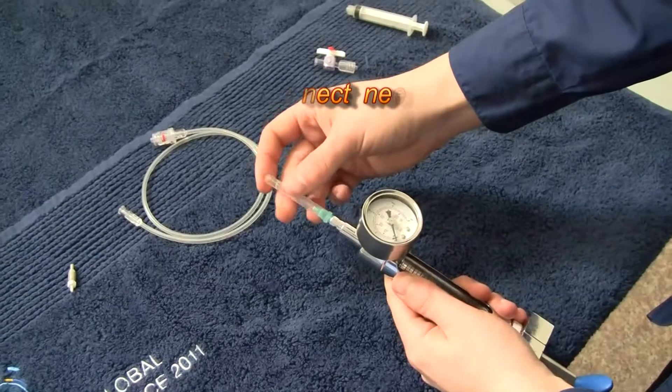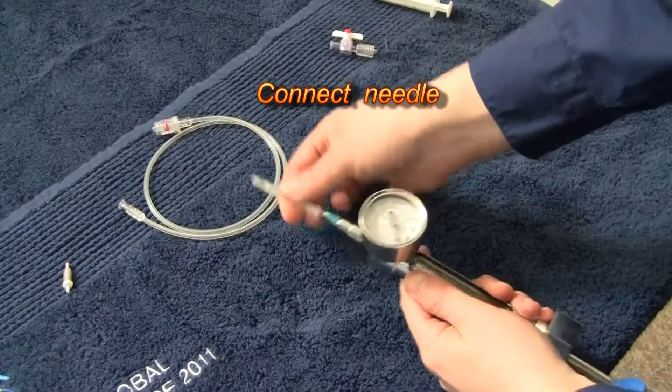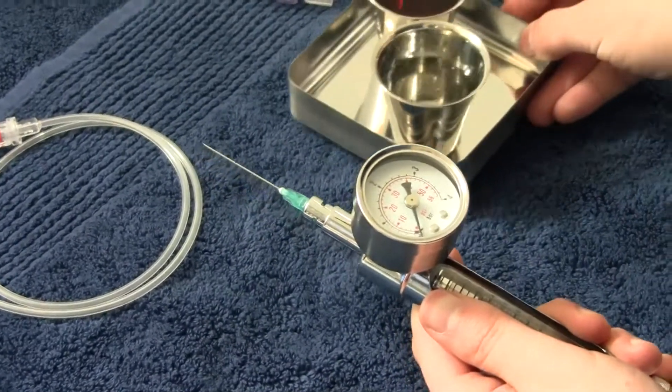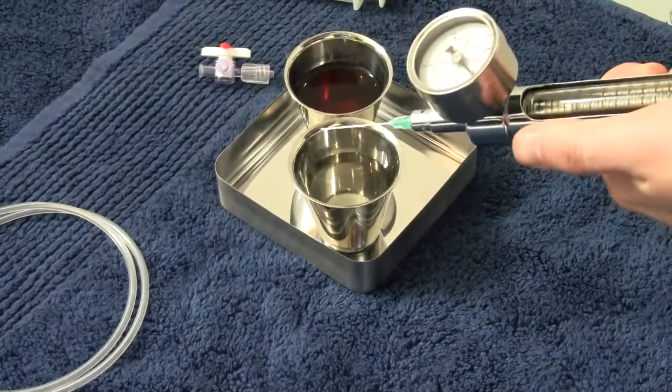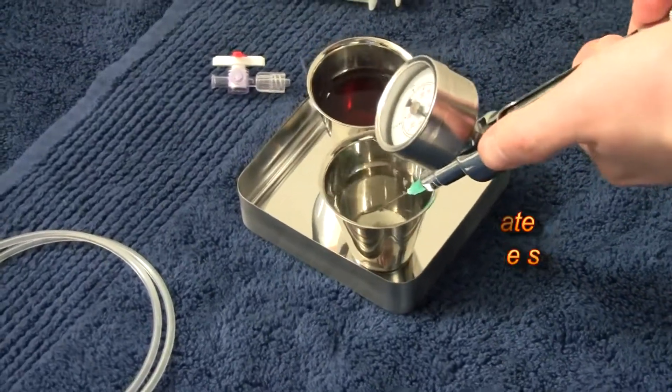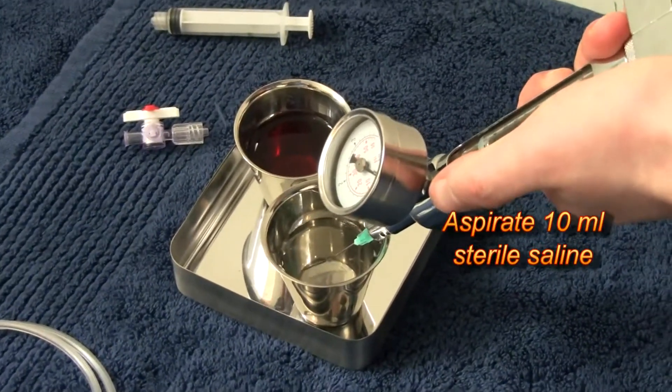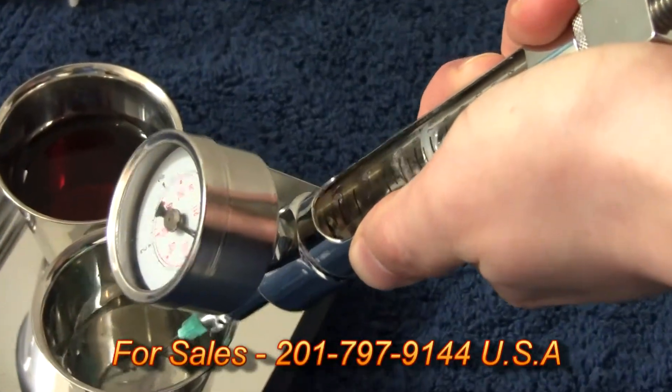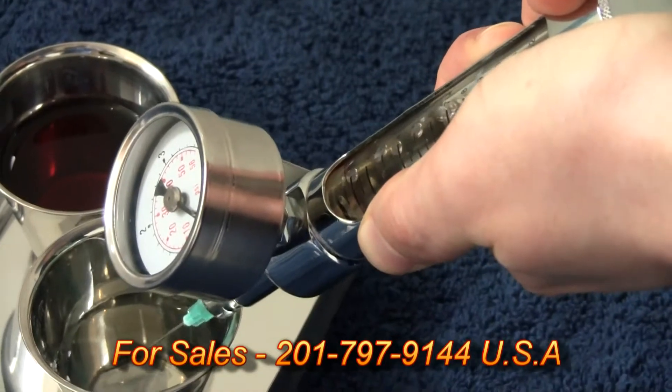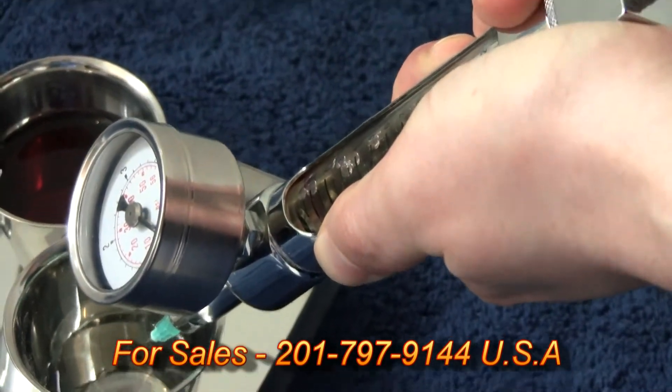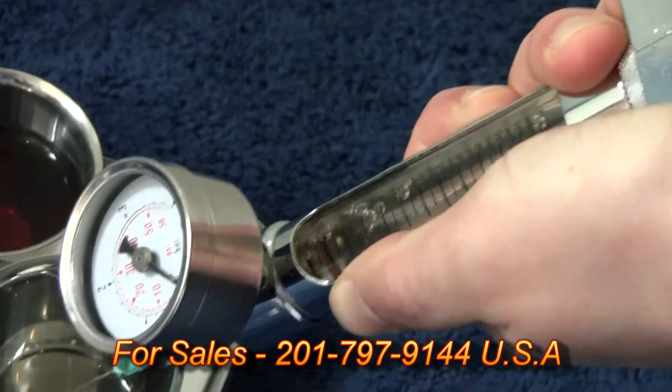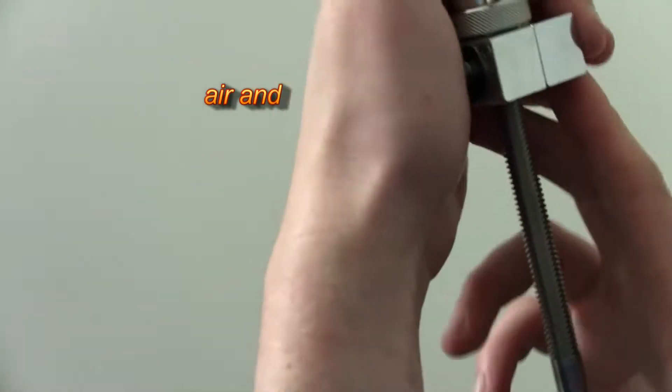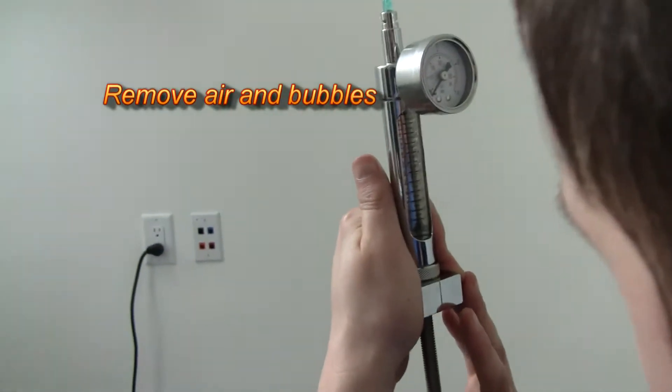Connect the 21G needle to the indeflator. Aspirate 10ml of sterile saline. Remove the air and bubbles from the indeflator.